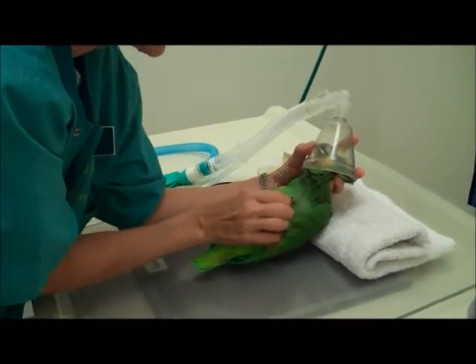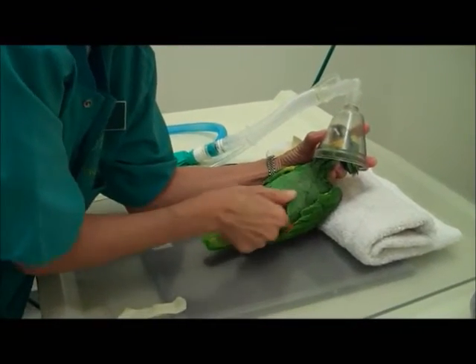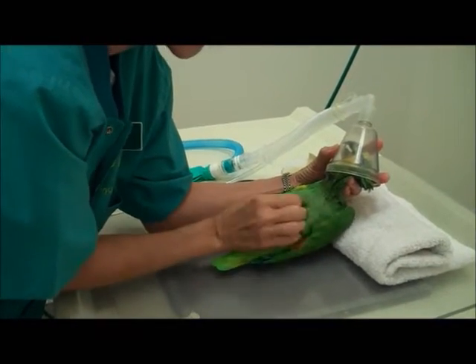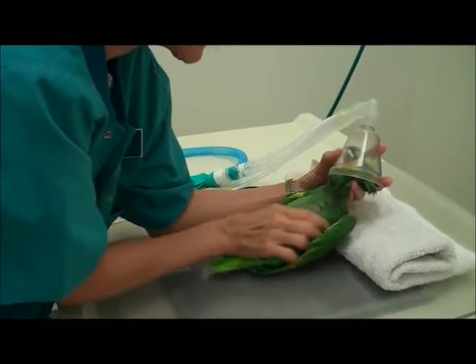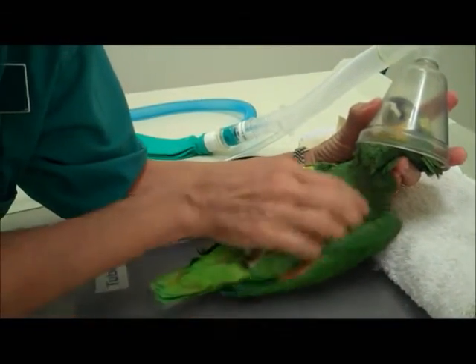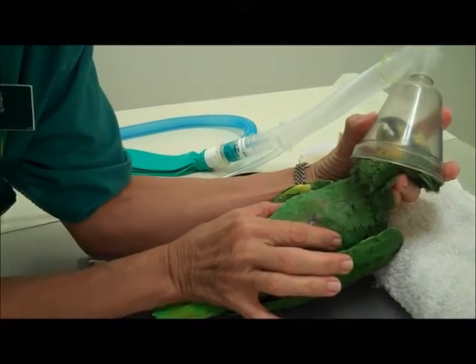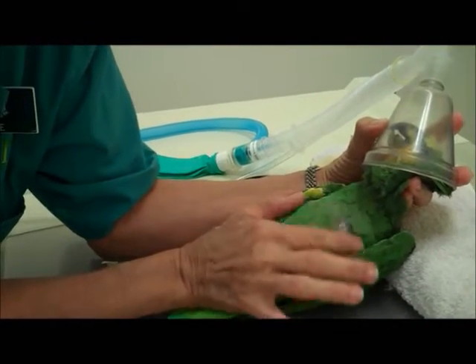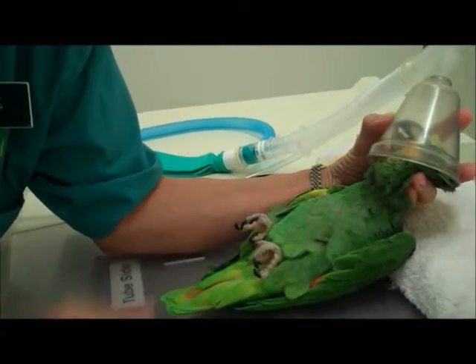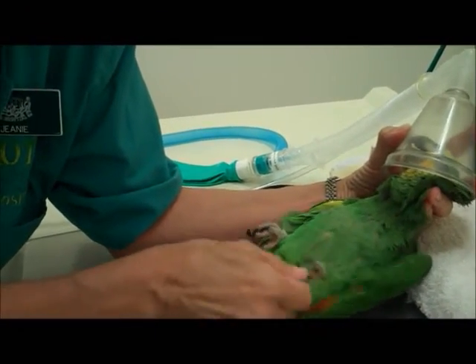I'm stimulating, encouraging those breaths to continue. I'm waiting for some reflexes like toes gripping and eyes blinking. This is just stimulation to encourage him to wake up. Good boy — good strong heart. Good breaths. I'm going to stay like this for another minute maybe. Get the tape off my arm. Just stimulating him to wake up.